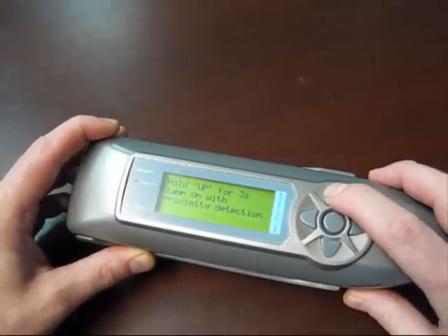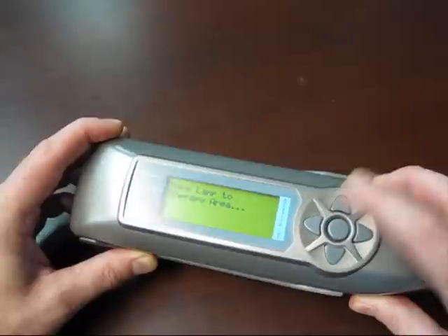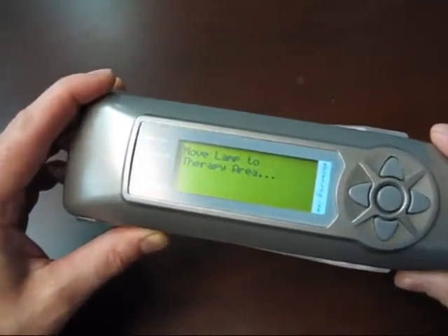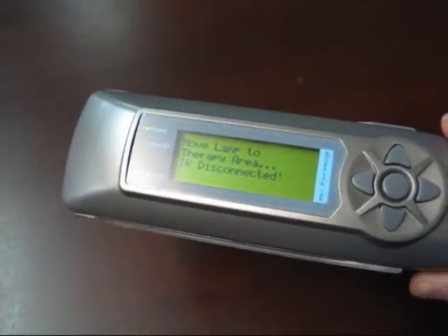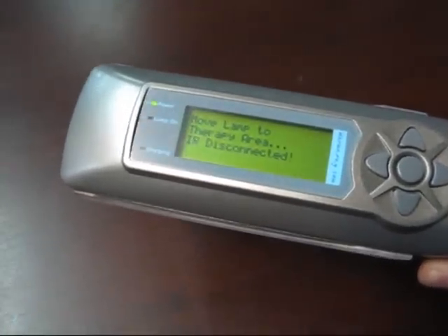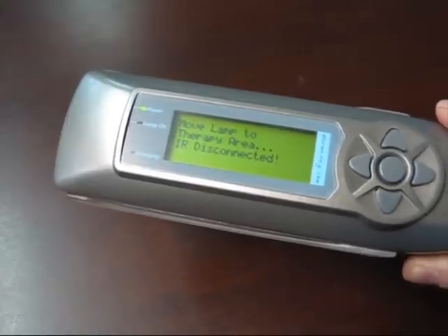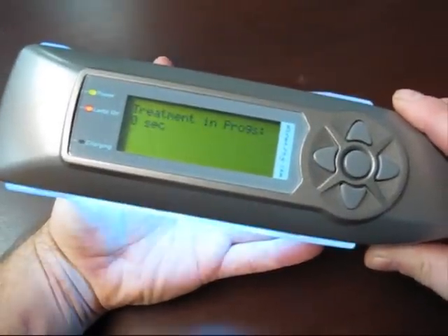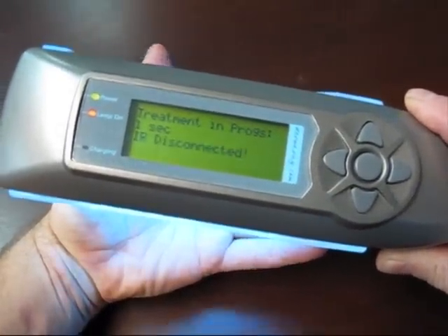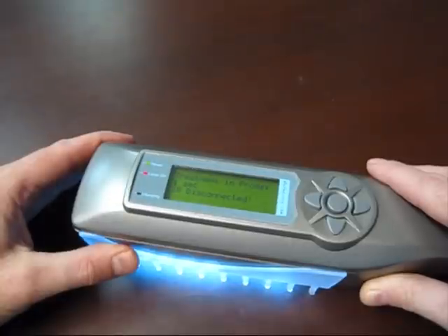3 seconds is a precaution, so it can't be accidentally activated. You'll see the device now says move lamp to therapy area. It's actually turned on and ready to be activated now, but it won't start the ultraviolet light transmission until it detects proximity to a treatment area. For example, my hand. Or the bench.